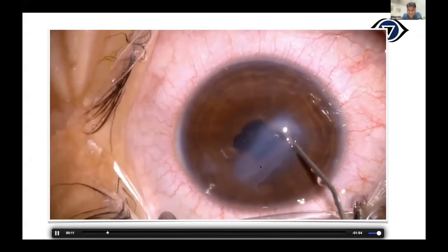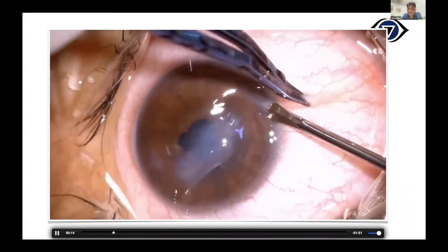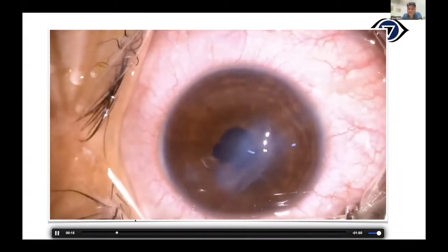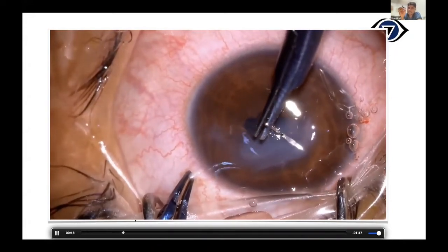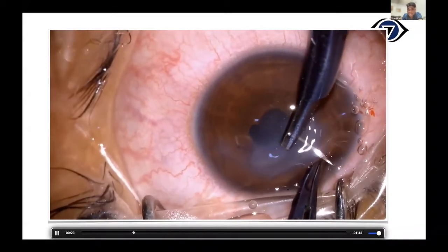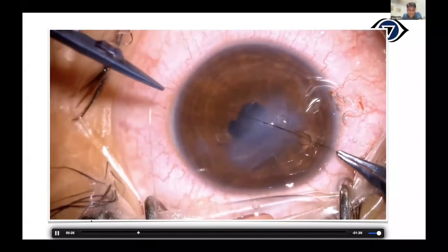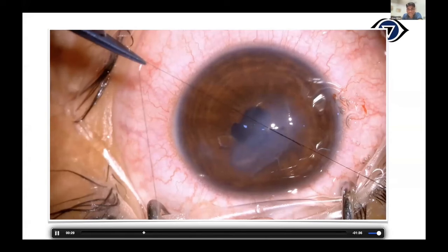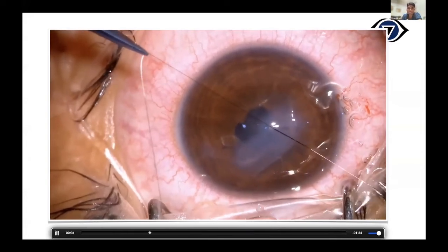You can see this is a shelved kind of incision. And again, when you do the eyes, this is difficult. I will highlight this again: when you do an AC tap or an MVR, it is important to give counter traction as well. Here I'm trying to use a no touch technique, meaning I will not try to touch the wound. Here it looks unequal, as if this is small and this is large, but it is not like that because of the shelved incision; inside, the posterior margin is somewhere here. So it is equidistant from this point. That is something we need to understand, how we are taking the equidistant sutures.